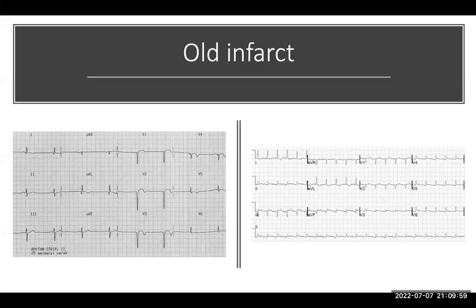Maybe the patient has got inferior MI and an AV block. Because if you say inferior MI, you get a mark. If you add AV block, you get another mark. So try to scan everything, just be calm, go through very fast. Always think of the differential diagnosis. If you are seeing LVH, ask yourself, what could be the cause? It's better you mention 2 common things than 5 uncommon things. If you just say hypertension and aortic stenosis, you'll get more marks than starting with some weird disease.